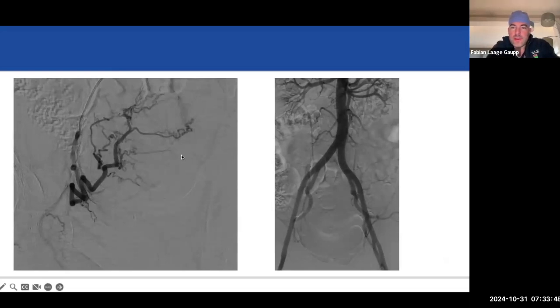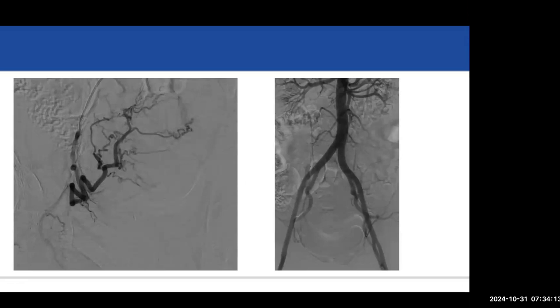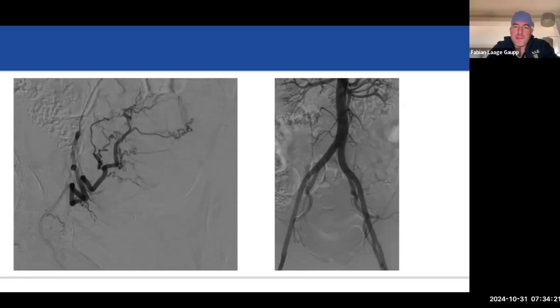And then some people do, some people don't do an aortogram either at the beginning or at the end. I typically do it at the end, because either way we're going to embolize the uterine artery, so we can go ahead with that. But then after that, you do an aortogram. And what are you looking for in the aortogram? I mean, before the procedure? Yeah, like why do we do the aortogram? Is there something else that you're looking for here?